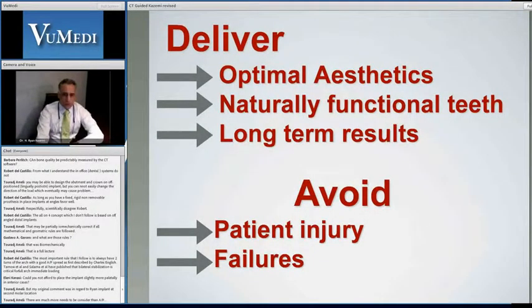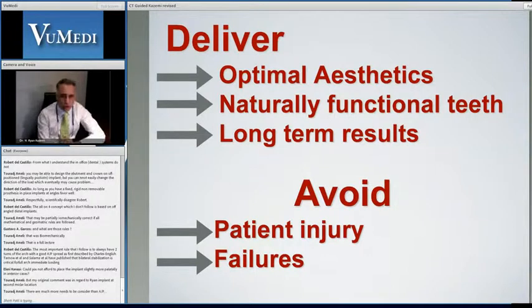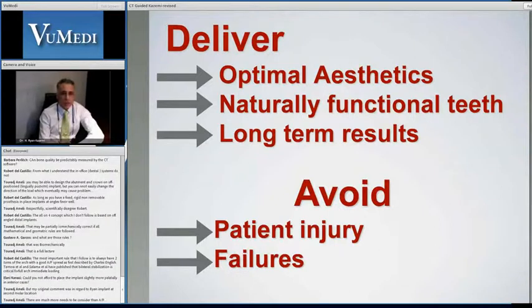Again, to come to a close here, I think that what this technology and this approach has allowed us to do is to primarily deliver the aesthetics and the function that we're looking for, as well as long-term results, because we know more. We have better idea of what we're doing, and with more accuracy, and also primarily avoiding patient injury, failures, and other things that can happen from a lack of better vision.